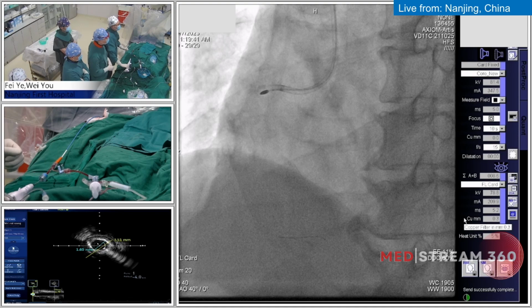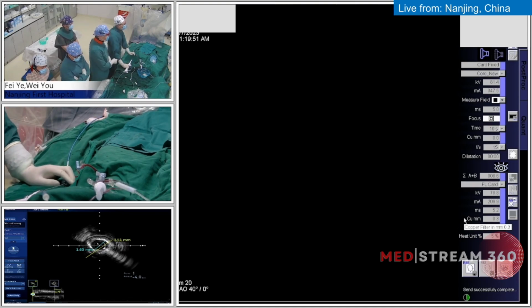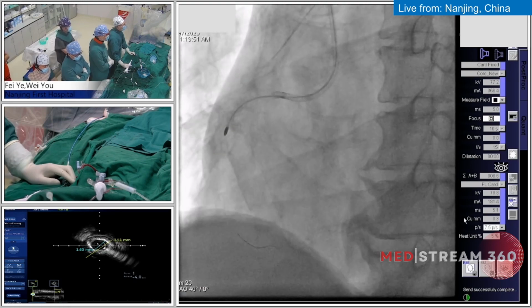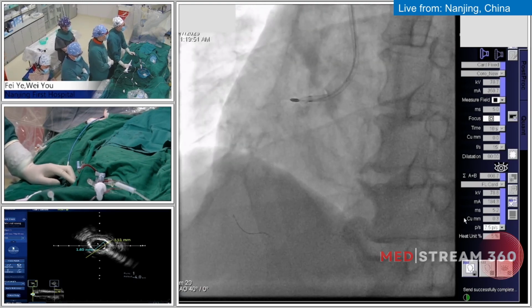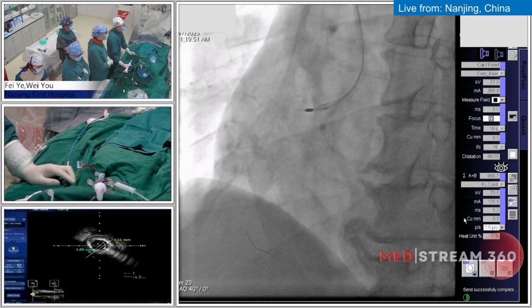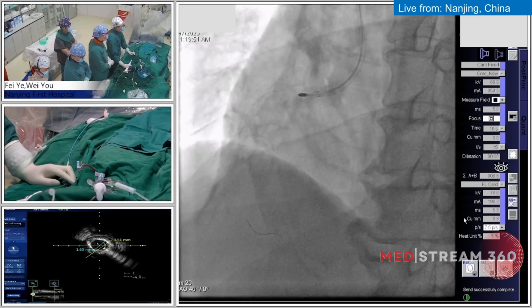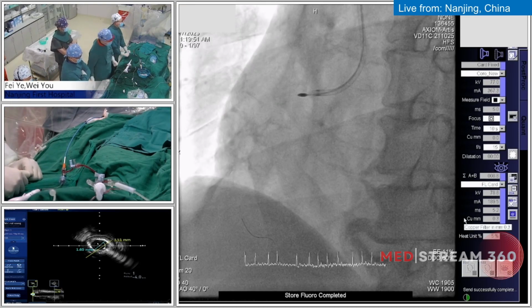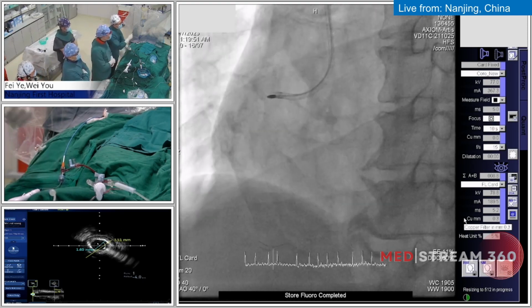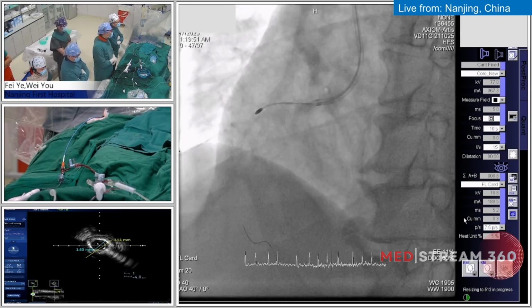The high speed mode. Okay, increase the speed. 160,000. Enough. 5 seconds. 10 seconds. Okay, I can see some movement. We can just see the advancement of the burr. 15 seconds. Increase the speed.